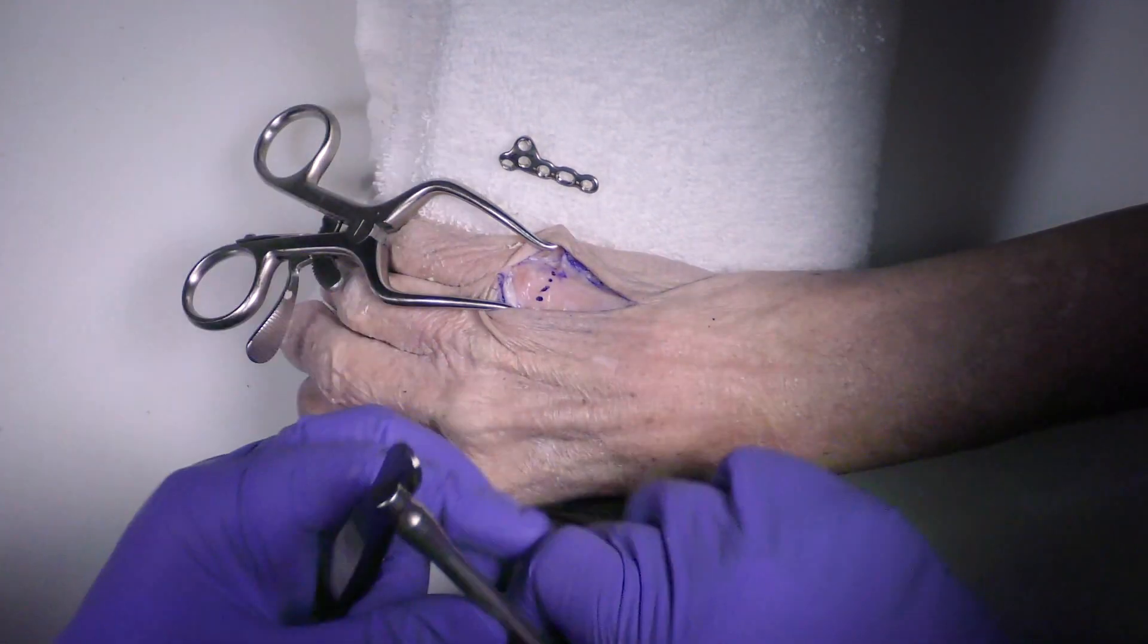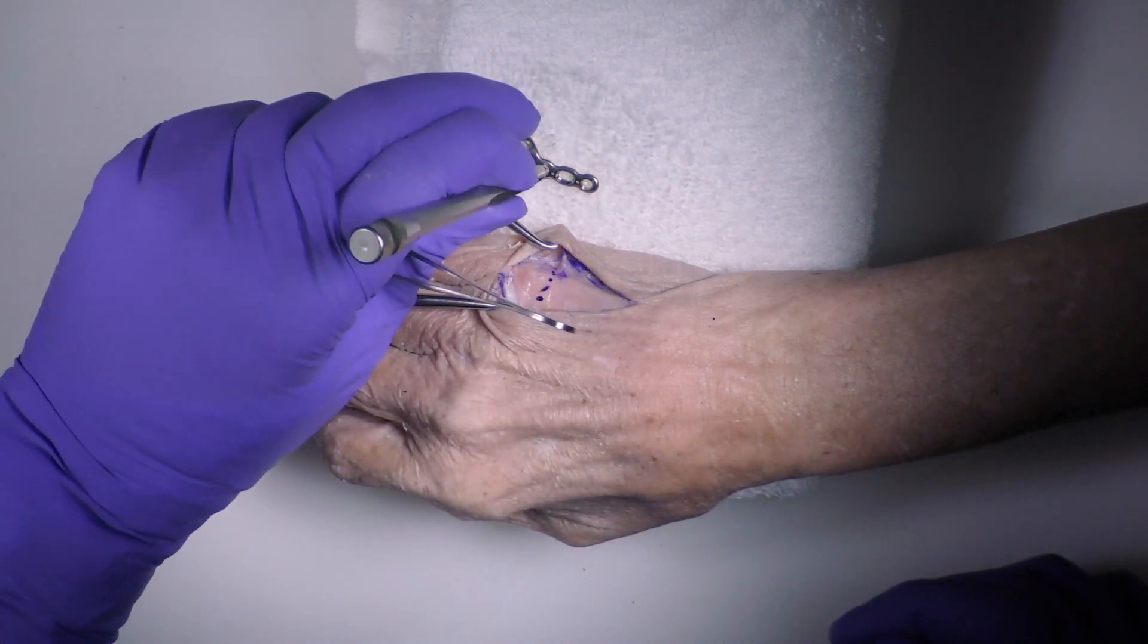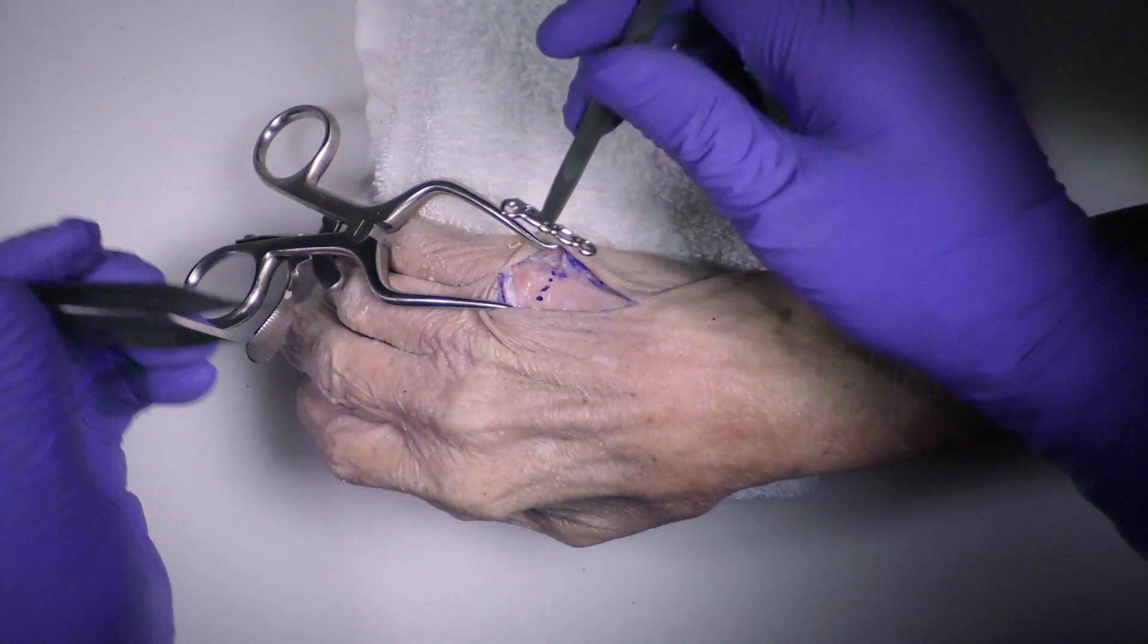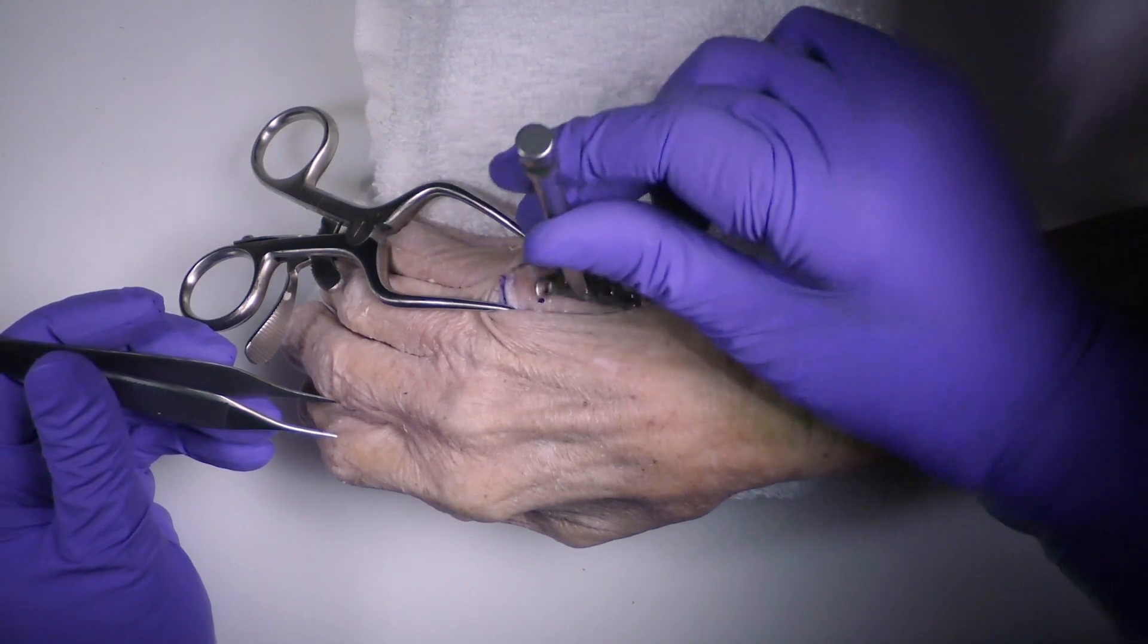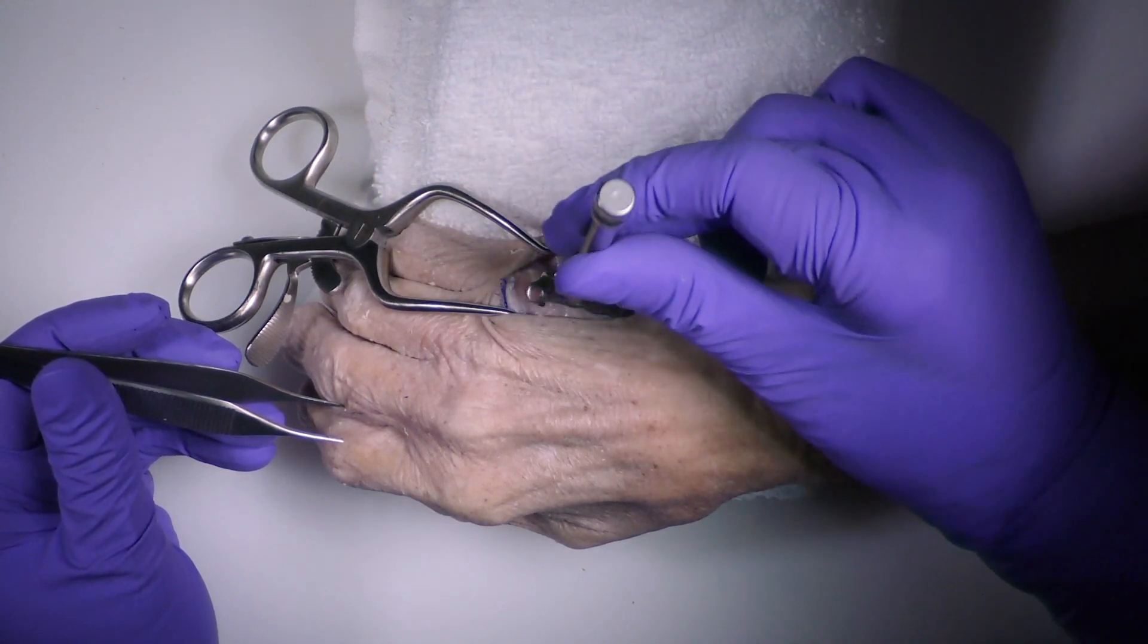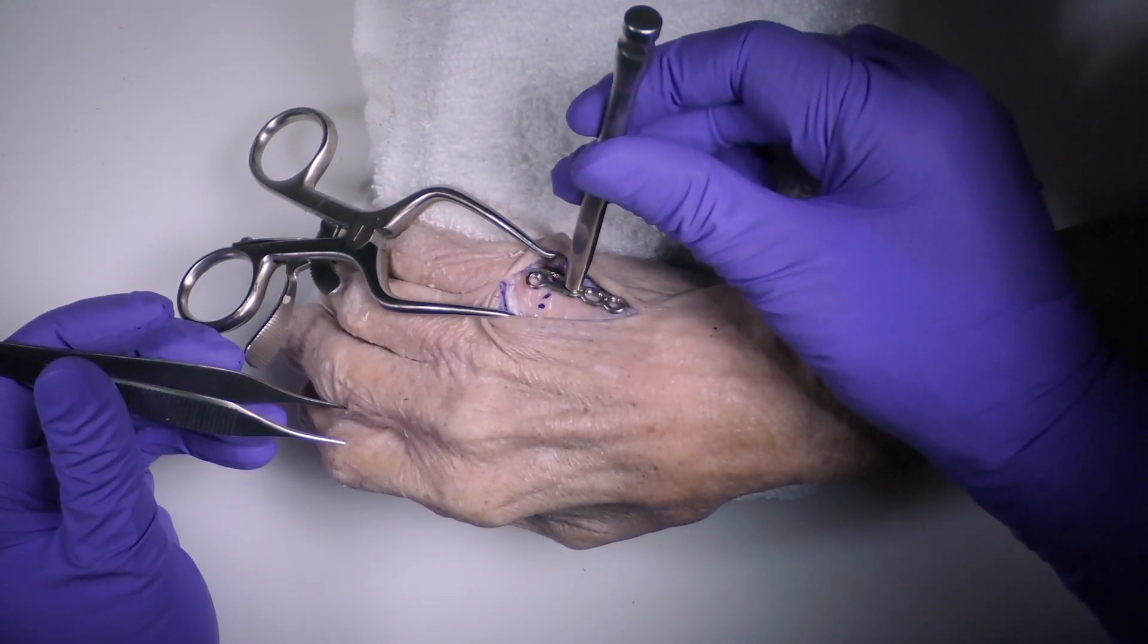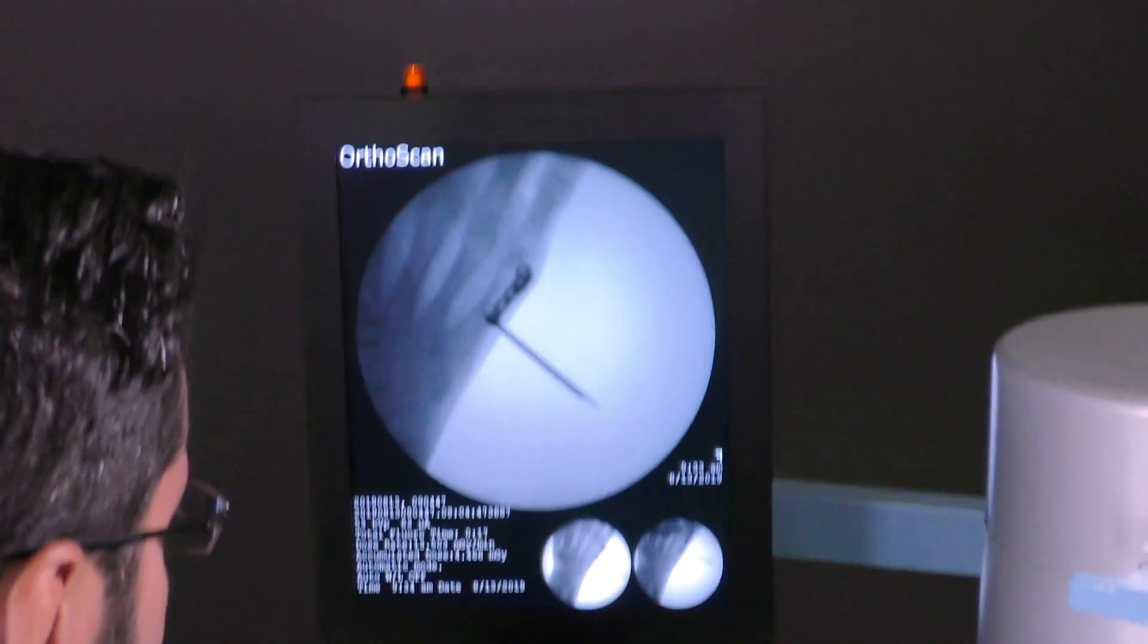So again, we'll apply this. That's a neat little nifty little holder. And again, it doesn't go straight dorsum, it goes off axis just a little bit like so. So here we go.